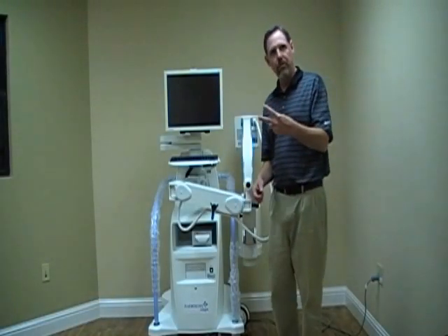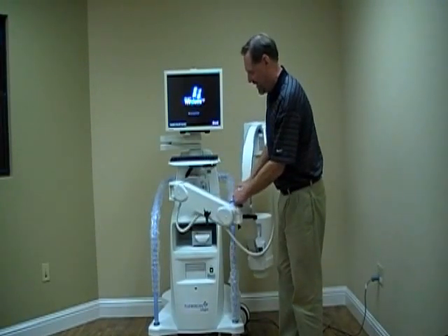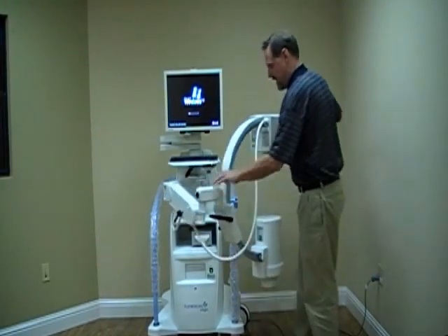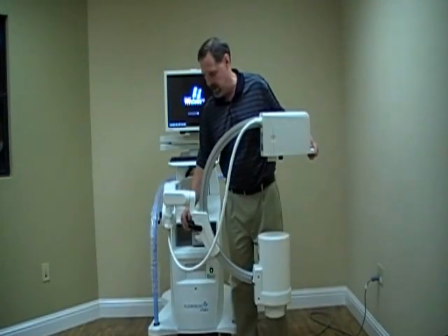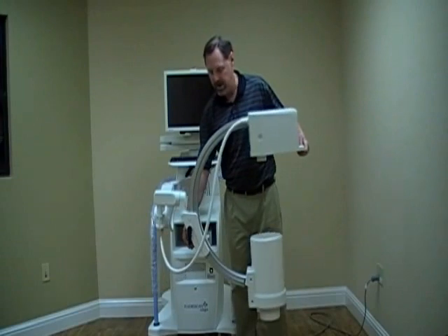There are two handles on the system. One handle here takes the arm up and down when it's locked, or it will not go up and down. The other handle is right here — this one will allow rotation of the arm in this manner.